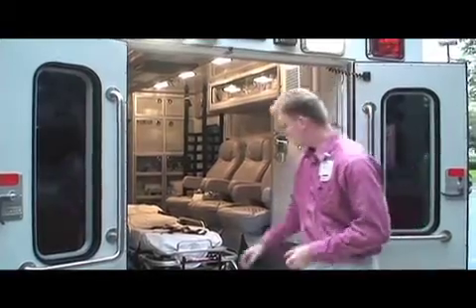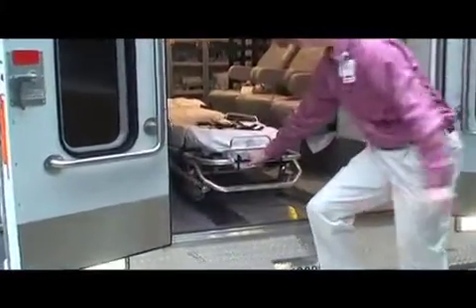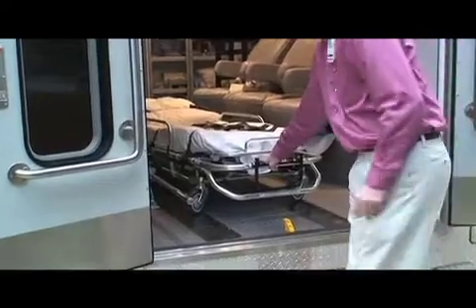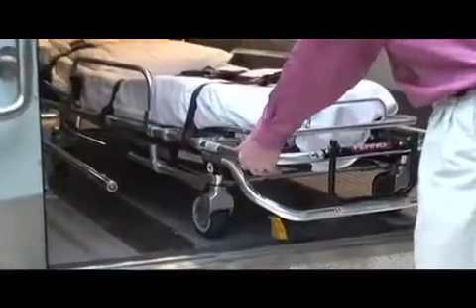We're going to go over loading and unloading of the stretcher. To release the stretcher from the ambulance, you're going to push this knob forward until it locks, and then pull the stretcher out to the right side. You'll pull it out, and then squeeze this handle over to the left-hand bar.